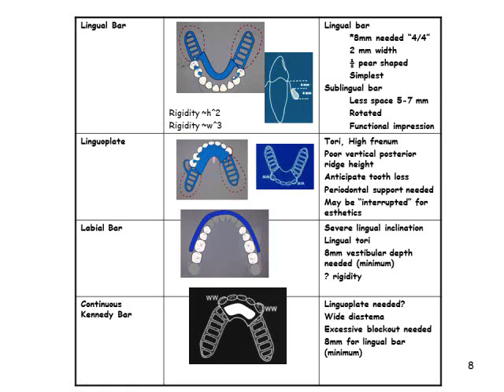It is 1/2 pear-shaped with the bulkiest portion inferiorly located. The superior border is tapered. It should be located at least 4 mm inferior to gingival margins and more if possible. The inferior border is located at the height of the floor of the mouth, when the patient's tongue is slightly elevated. A long bar requires more bulk than a short bar, however, the cross-sectional shape remains the same.